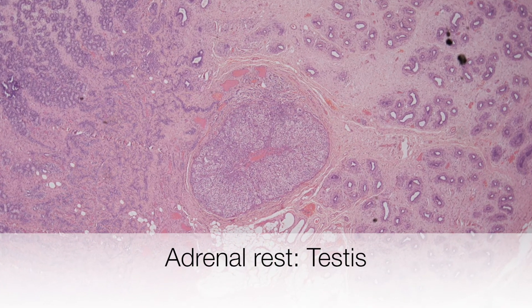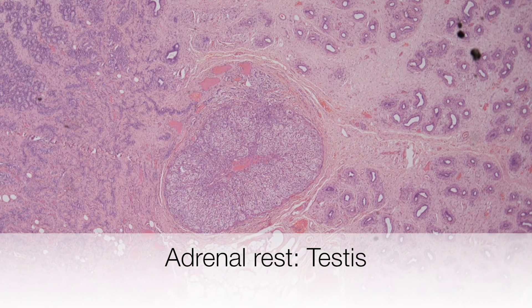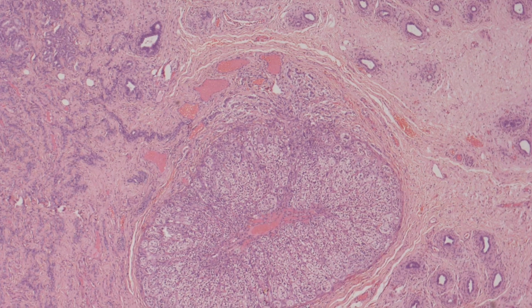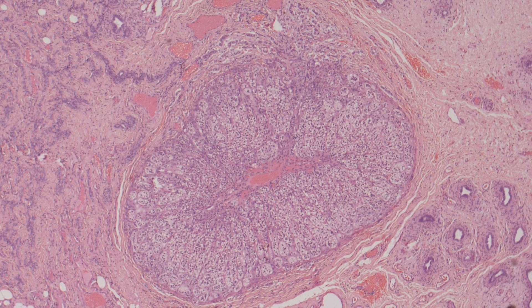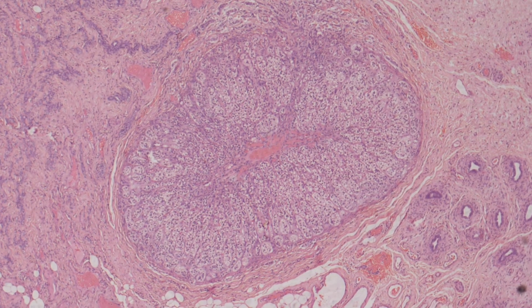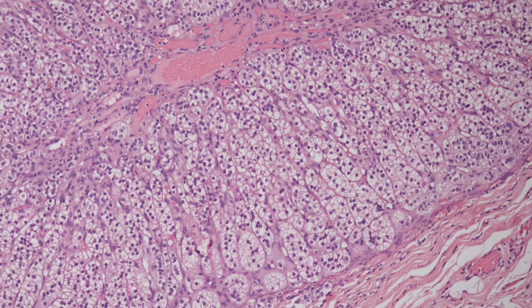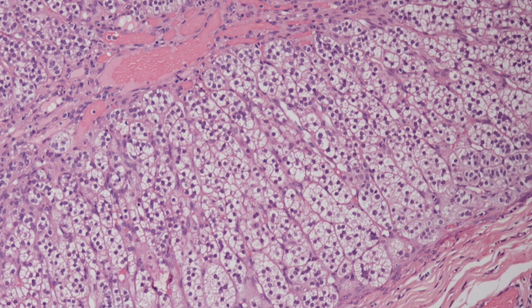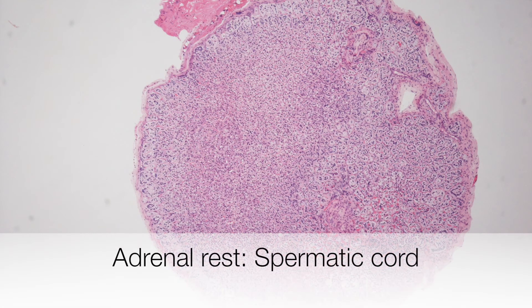This is a low-power view of an adrenocortical rest in the testis, which is situated between the epididymis and the rete. And here is a high-power view. And this is a low-power view of an adrenal rest of the spermatic cord.